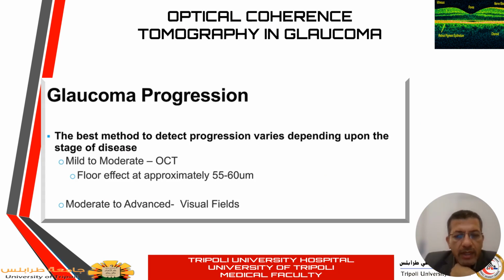Now, an important subject for every doctor who is interested in glaucoma is glaucoma progression. In the previous slide, we spoke about glaucoma progression using OCT angio. But now I want to speak generally about how to establish a glaucoma progression analysis program, or guided progression analysis.